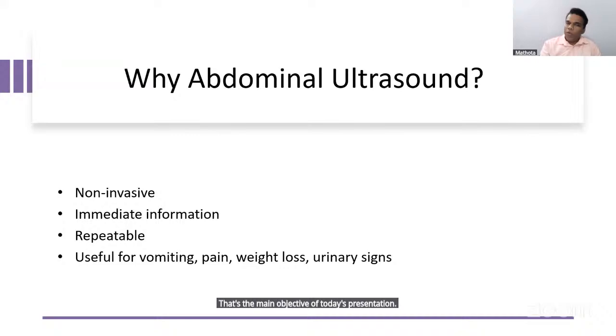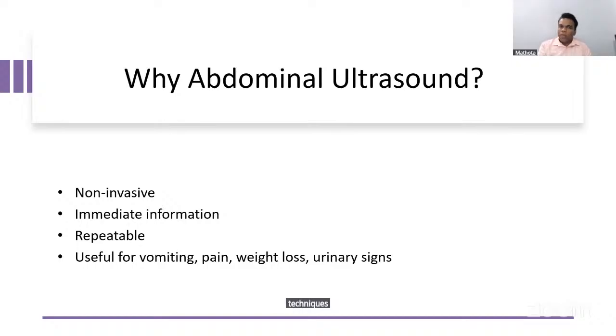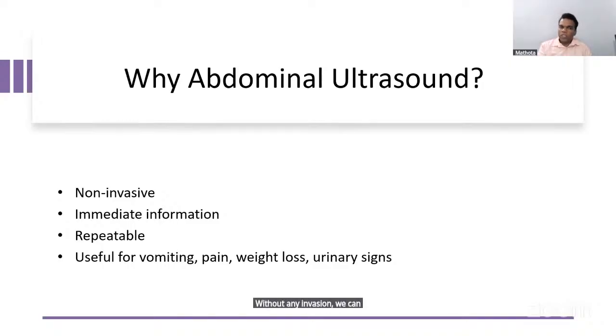So why do we use ultrasound? This is a very important thing. This is a non-invasive diagnostic technique. We can always use this diagnostic technique without any damage to the animal, because it is not invasive. We can see images of the animal's internal organs without any invasion. We can keep the probe on the surface of the body and see internal organs.